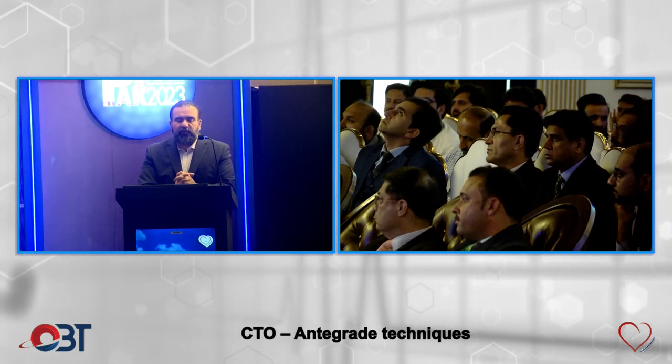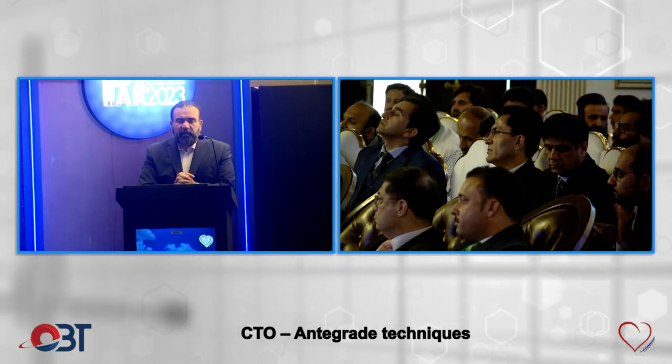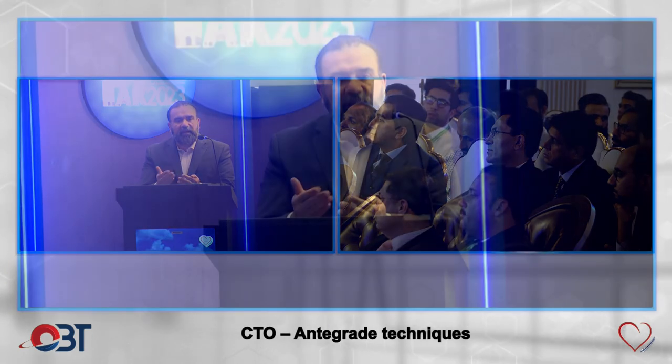So I would say that my preference would be, if you end up being subintimal, is try what Tariq Bhai did, dual lumen catheter, or maybe take another catheter, go alongside it, do Carlino. Or what you can do is, you can do a more classic parallel wire technique and try that first. And if you have stingray, you can try stingray.